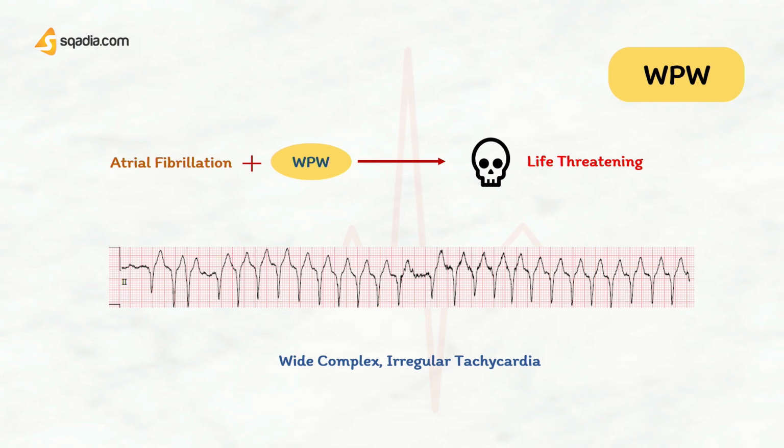So there we have it. We have just covered the common ECG abnormalities and their characteristics.